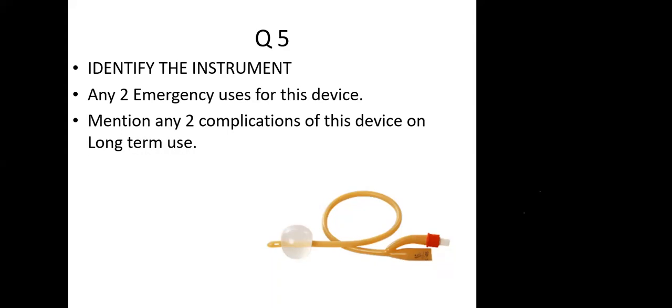Okay. The next one will be in an elective urology setting. If you are doing a TURP, you do not need the balloon inflated to a larger volume, but some people still do that. But if you are doing an open prostatectomy, particularly a Freyer's prostatectomy, it is mandatory that you should have a 3-way Foley catheter, not this one, in which the balloon is inflated in the bed and you give a traction at the neck of the bladder to produce a hemostasis.